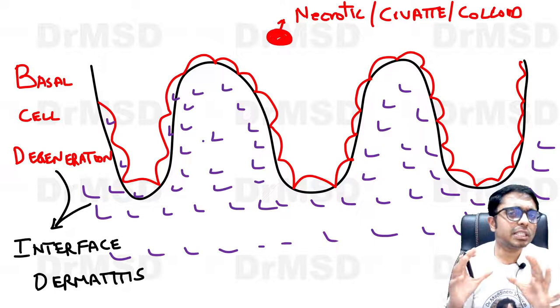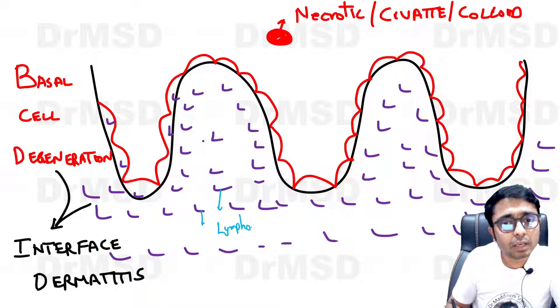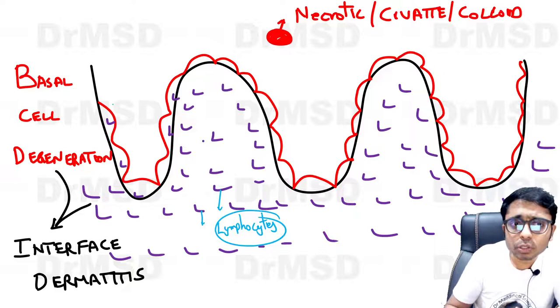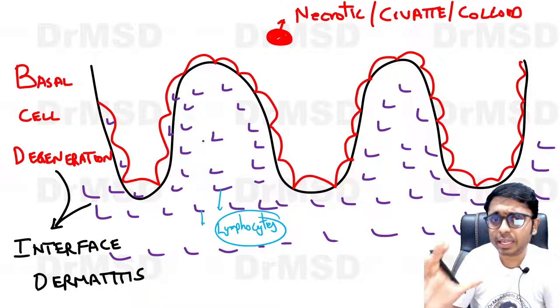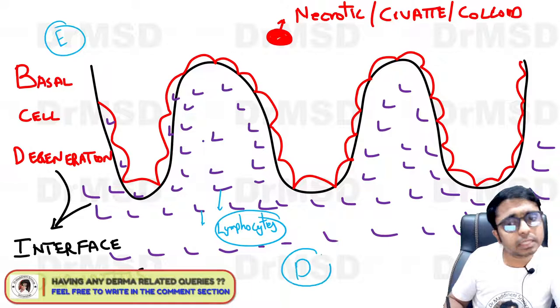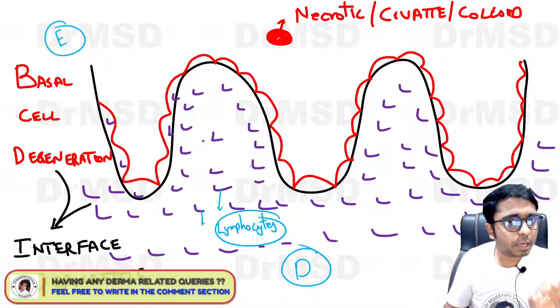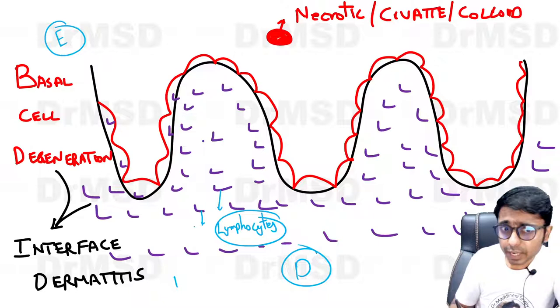To give a quick orientation: the purple-colored structures visible in the image are all lymphocytes. The crests and troughs you see are the rete ridges and dermal papillae — we are looking at the dermoepidermal junction in a magnified view. The lymphocytes are present at the junction between the epidermis and dermis. In lichen planus, these lymphocytes are seen in a very confluent manner, and this is given the name band-shaped lymphocytic infiltration, which is very important.